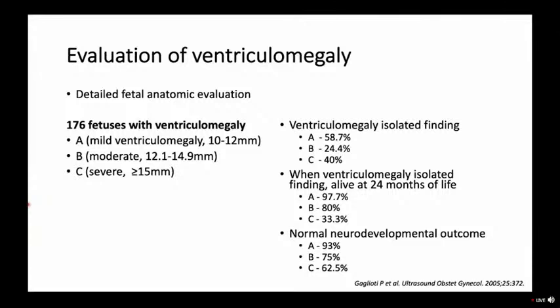The size of the measurement predicts the outcome for the baby. Does the baby have a normal outcome like we hope and desire for our children? Does the baby have a normal IQ? If it's mild, almost always. If it's severe, 16, 17, 18 millimeters, 40, 50% of those babies are going to have some IQ deficit related to the ventriculomegaly.